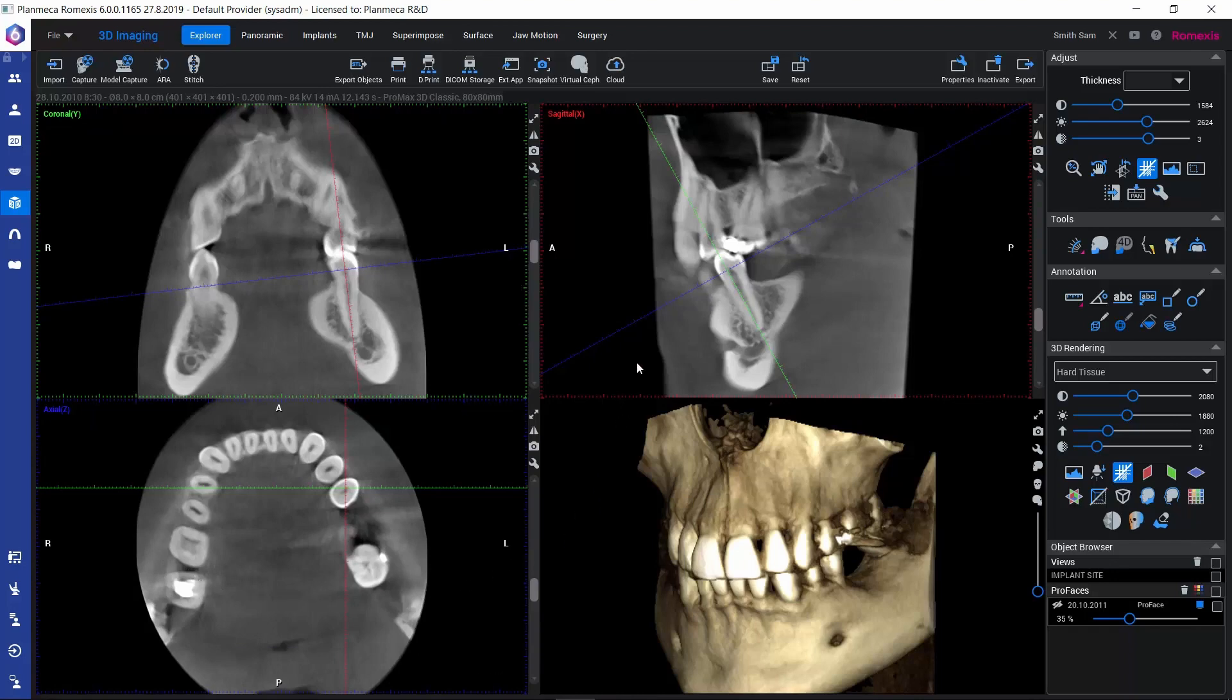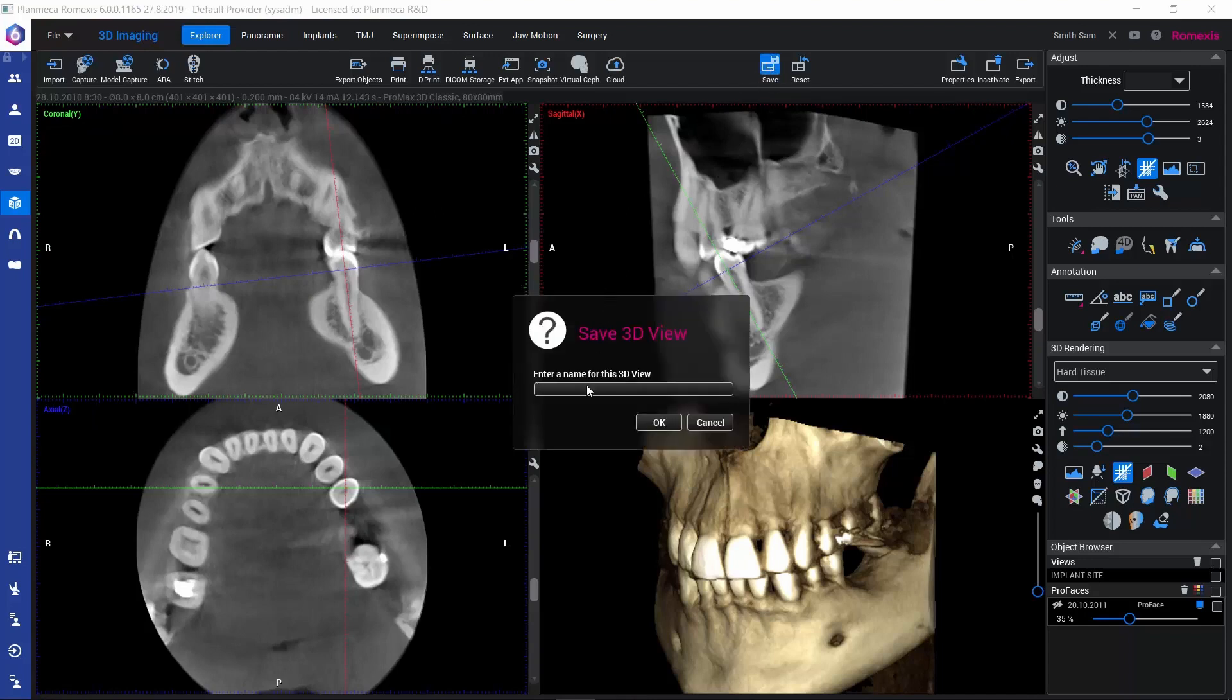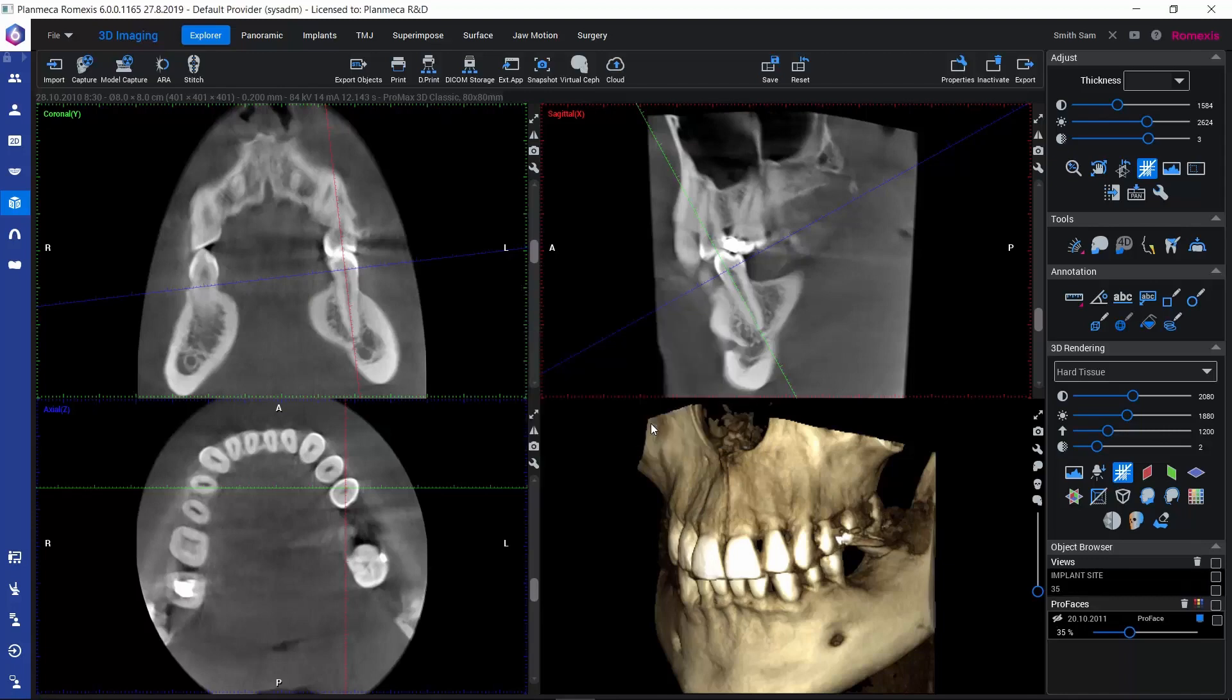In order to save this, we can go to the upper toolbar and click on Save. This allows us to specify a name for our view. For example, we could put a tooth number, the name of the finding, anything, and save that by clicking OK.